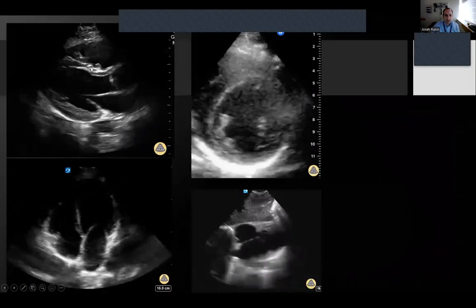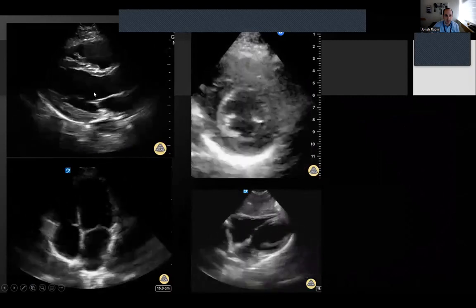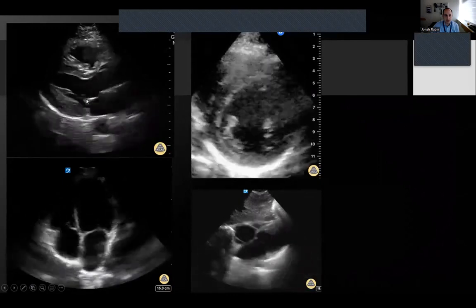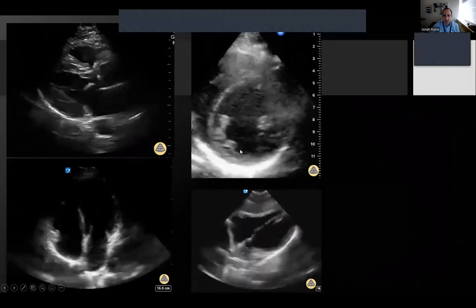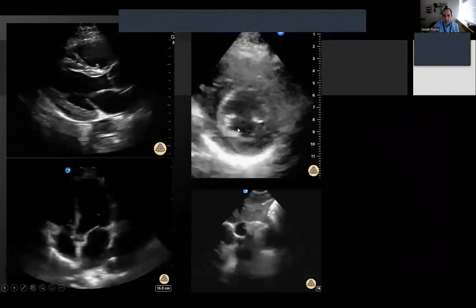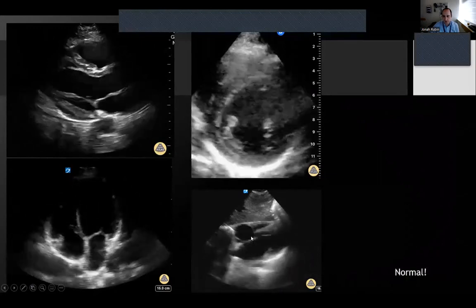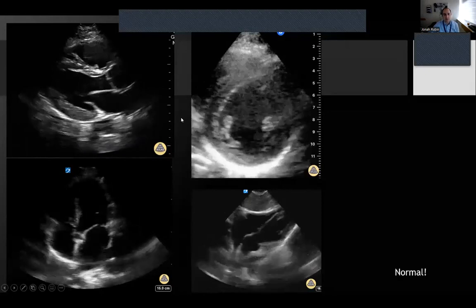This here again, you're seeing a lot of thickening, looks like more than 40%. This anterior leaflet looks like it's going up towards the base, towards the septum. This is an on-axis image with both your valves. Parasternal short axis here, thickening nicely, round, on-axis, you're getting these bean-shaped papillary muscles closing nicely. Mitral annulus moving up and down really nicely. This is a normal heart. Not hyperdynamic, not hypodynamic, normal.